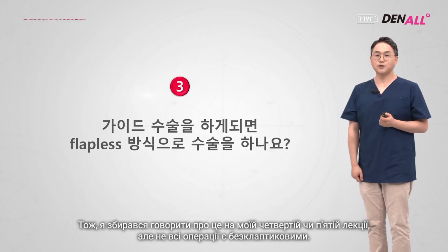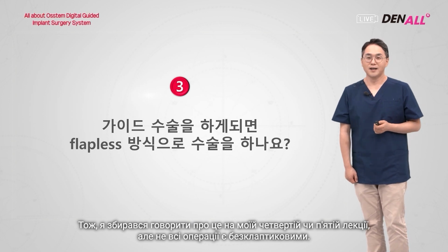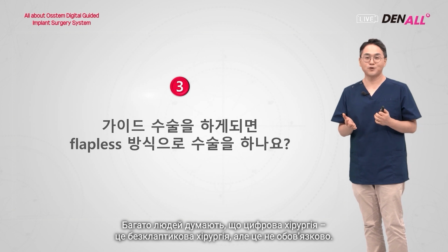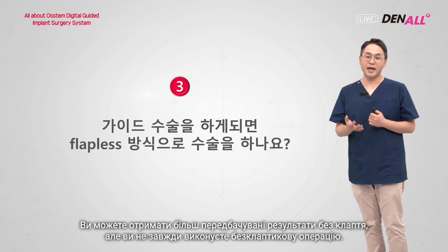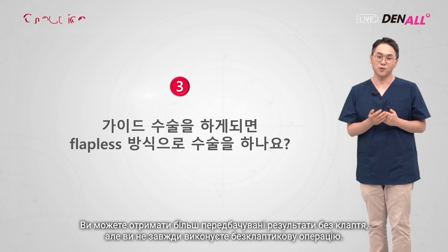Third, if you do guided surgery, is it all flapless surgery? I was going to talk about this in my 4th or 5th lecture, but not all surgery is flapless. A lot of people think that digital guide surgery is flapless surgery, but not necessarily. You can get a more predictable result flapless, but you don't always do flapless surgery.